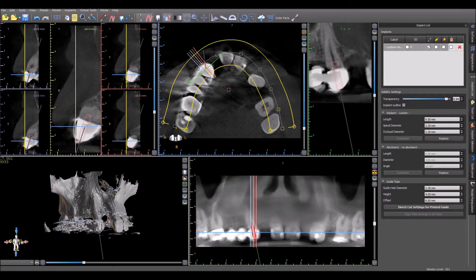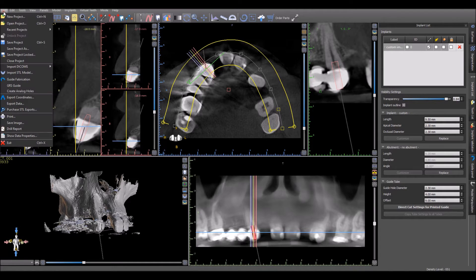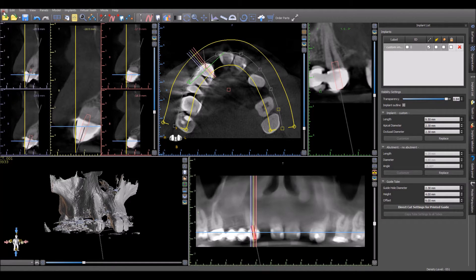Here's a video demonstrating the process of creating a root canal guide. Start by loading the patient scan as usual: file, new project.